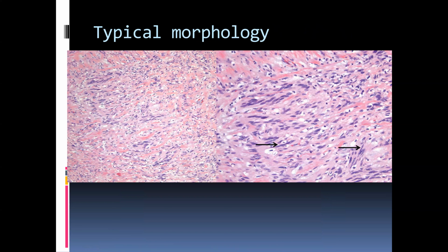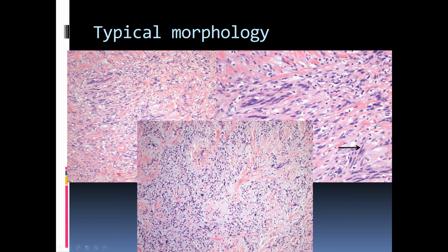Morphologically, schwannomas have a nice characteristic morphology, spindle-shaped cells, variable cellularity, and you can see here kind of pointy end nuclei. You can see these are not cigar-shaped; these are spear-shaped nuclei. We have, let's see, I think I have one more high power here. You can also see sort of a myxoid change in these lesions as well, which is nicely demonstrated here.